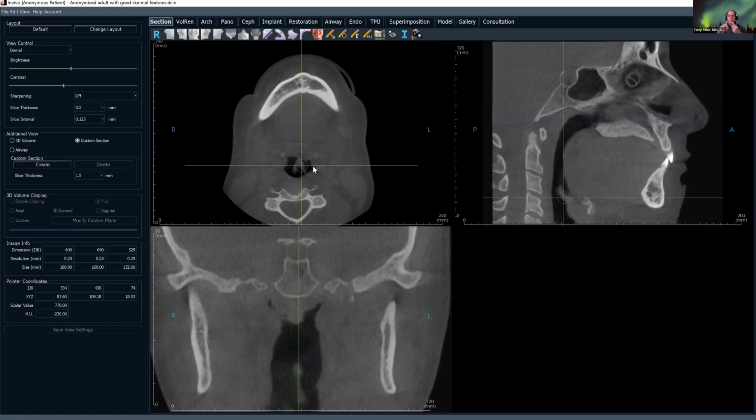So these are the structures that may fall in this area. We already talked about the tonsilliths. This is the hyoid bone. Ossification of the stylohyoid ligament may also appear in here, and sometimes it's not continuous. You may have interruptions of ossification of the stylohyoid ligament, and it may be ossified at one end, which is probably more typical from its origin. It may be more ossified there, but it could be intermittently ossified along its length all the way to where it attaches to the hyoid bone.